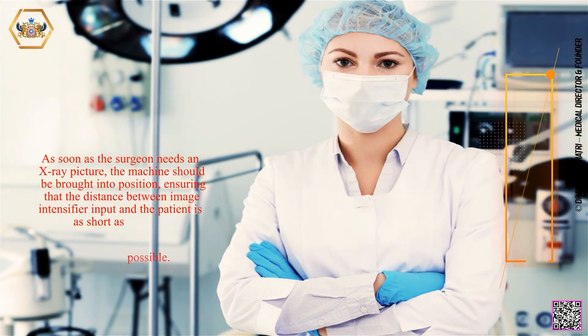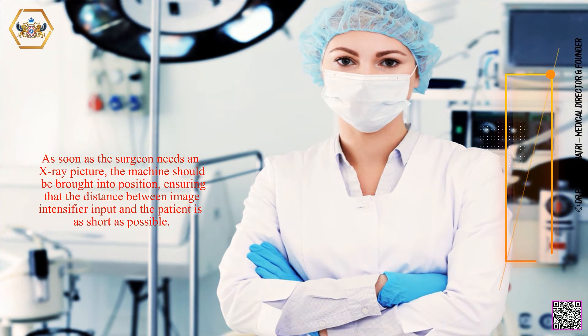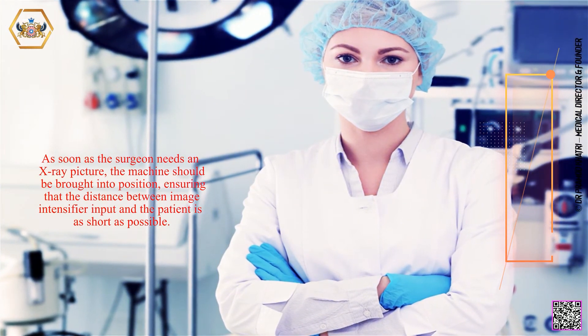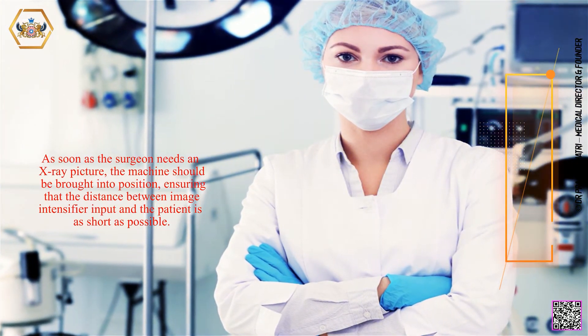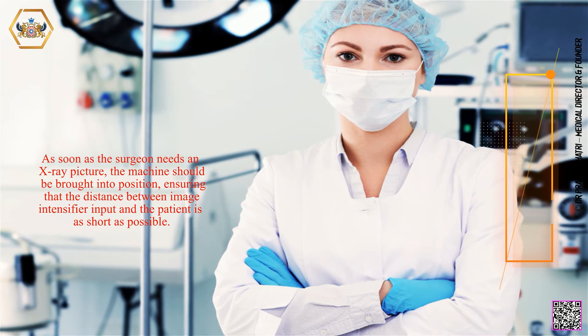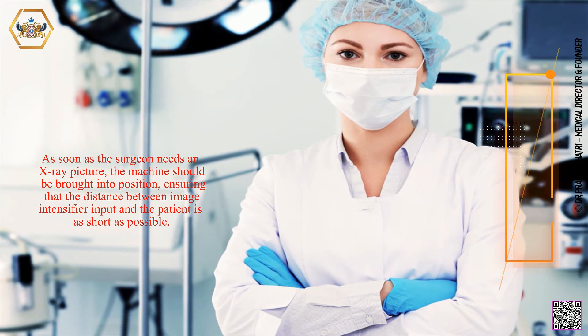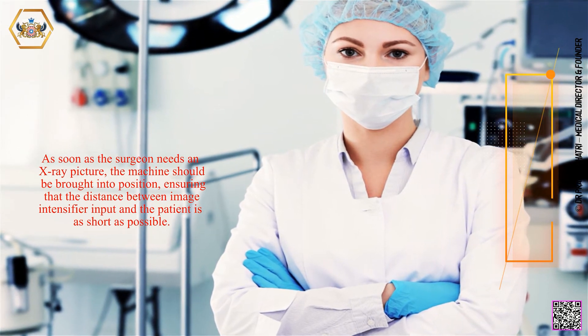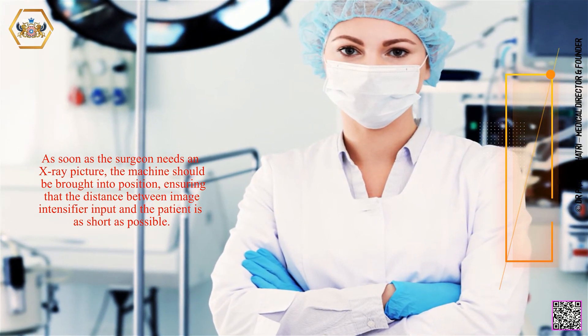As soon as the surgeon needs an X-ray picture, the machine should be brought into position, ensuring that the distance between the image intensifier input and the patient is as short as possible.